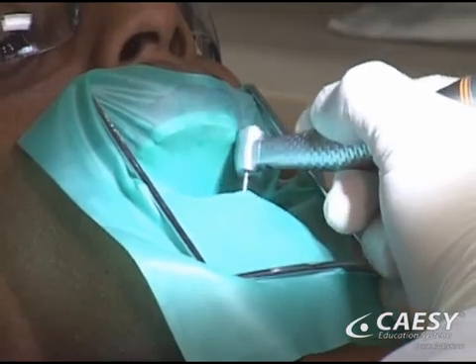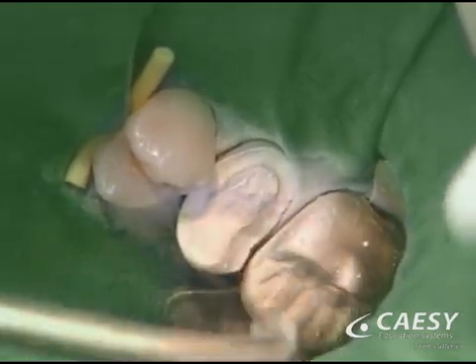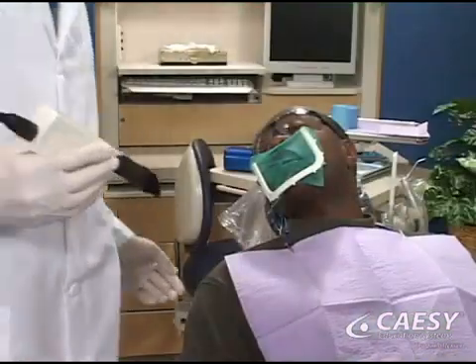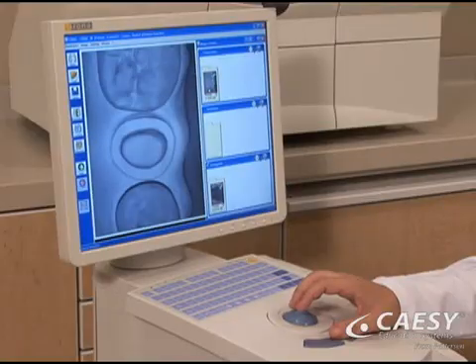We remove any decay and shape the tooth with a handpiece. Next, we apply a reflective powder to the prepared tooth. We then take a digital image using a special optical infrared camera that records the tooth's exact dimensions on the CAD-CAM computer.